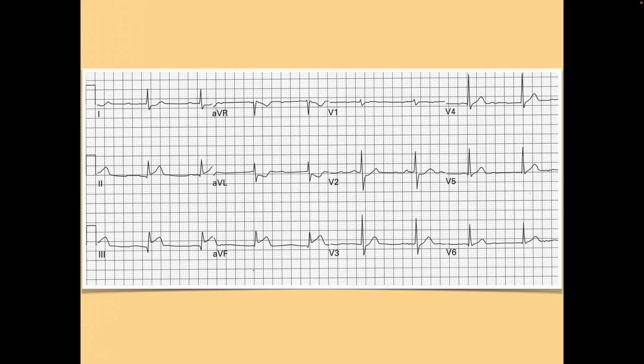So, let's see. Kyle, we'll start with you. I want you to show me where the ST elevation is in the inferior leads. There's quite a bit in 2 and AVF, and a little bit in 3. Yeah, so we meet our criteria here of 2 or more contiguous leads, okay? So any questions about this? We're going to be doing lots and lots and lots. This is just the first one.